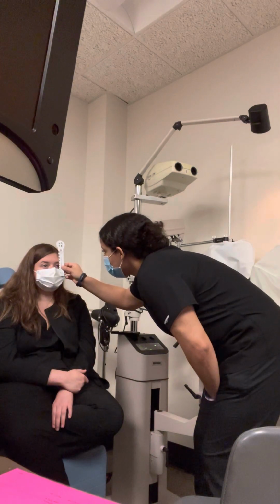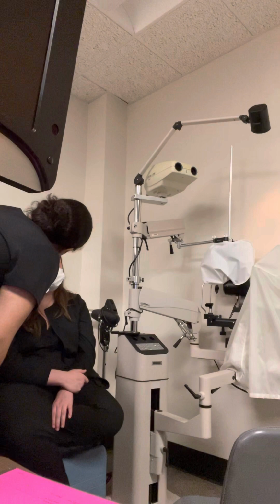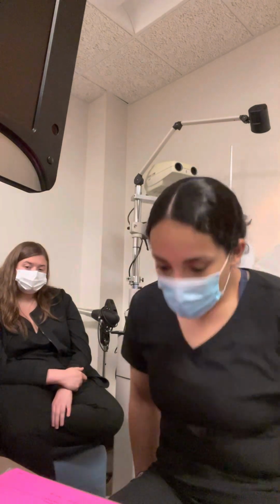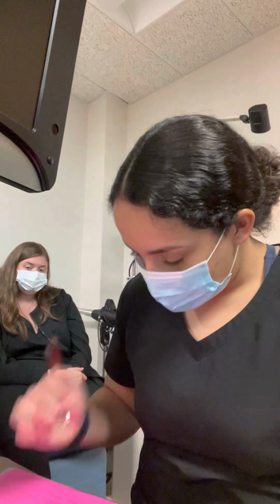So you are going to be holding up your hand in a triangle, just like this. And we're going to center that letter right in the middle of that triangle. All right, awesome. Read that letter to me. Okay. Awesome. I'm going to cover each of your eyes. Her pupil sizes in dim lighting were 6 millimeters in her right and 6 millimeters in her left, and that can just be due to ambient lighting.